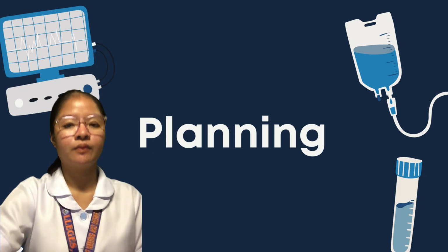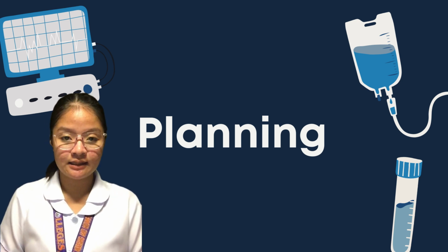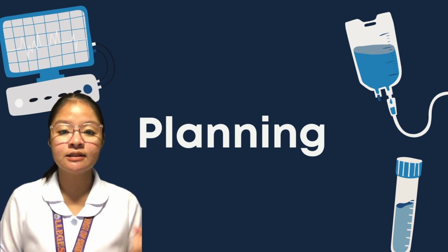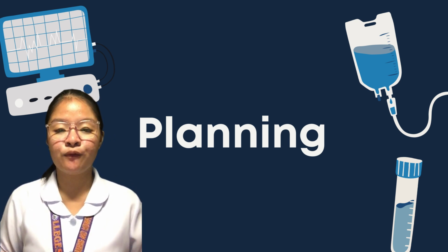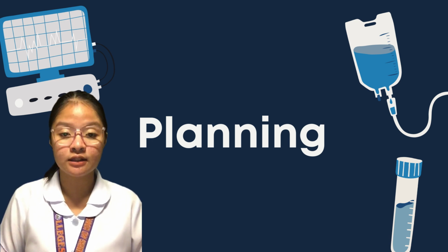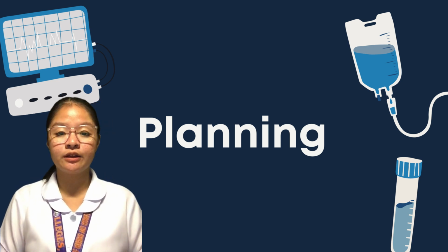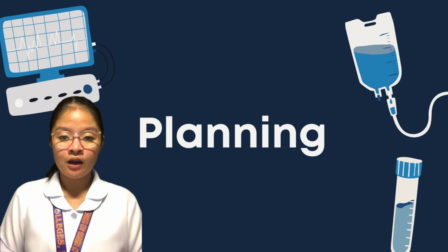Okay po. So after the assessing stage comes the planning stage. In this stage, we are going to prepare the materials, the patient, and the environment. For the materials, we need to prepare the materials beforehand. The materials we are going to use in this procedure were stated earlier. After preparing the materials, we are now going to prepare the environment for the patient.